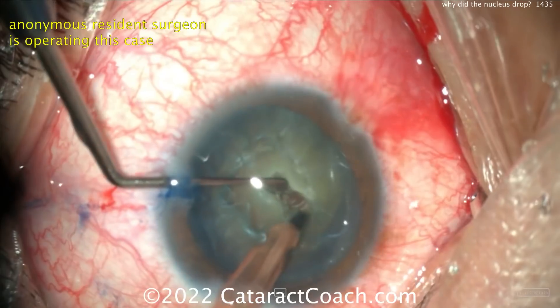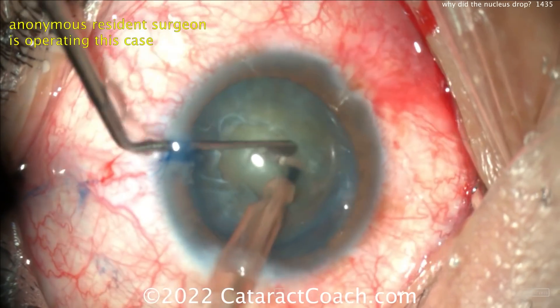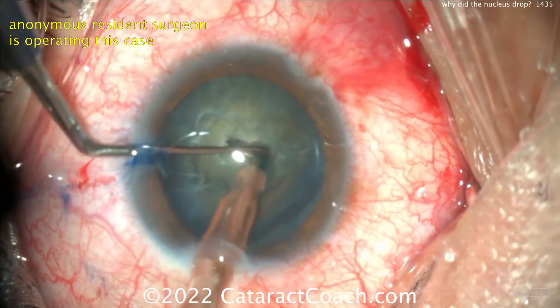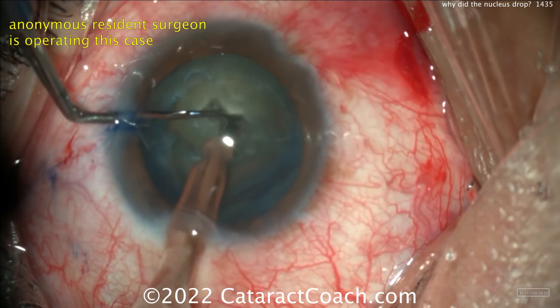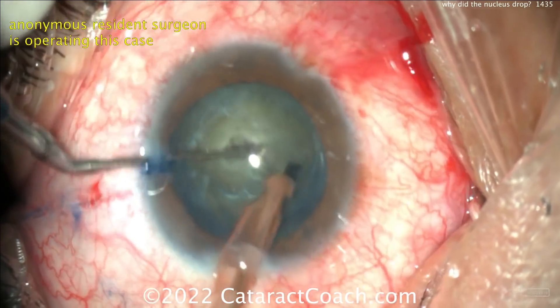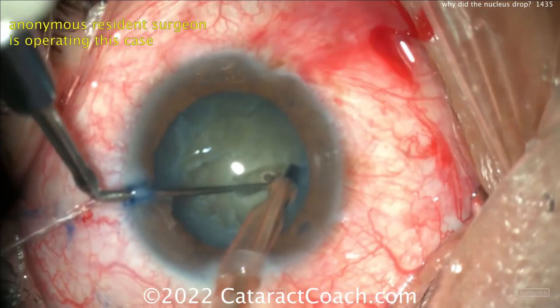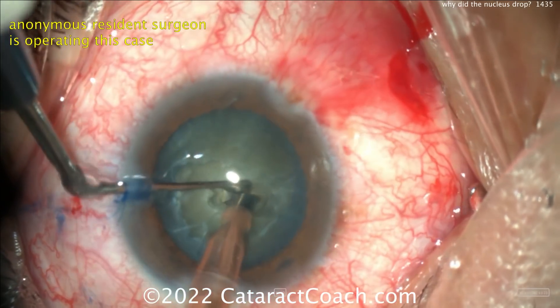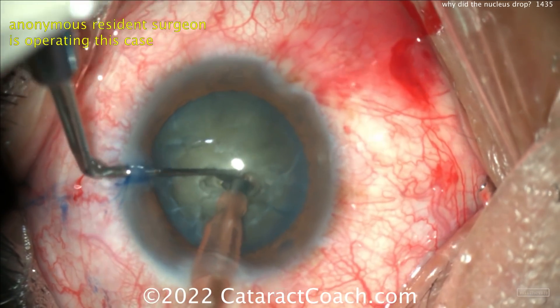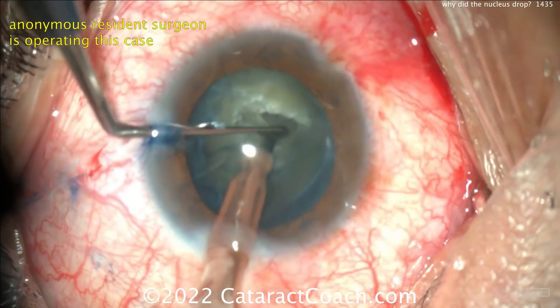Forget the upside-down text — the video was submitted originally in the non-surgeon view, and you like to see this view with the phaco probe right in front of you as if you're operating, so I flipped the video around. I would not split the nucleus here. I'd bring the nucleus up into the anterior chamber, use a chopper, pull it out of the capsule bag. If you do want to split it in the eye, fine — make it in two halves. But you need to convert to a manual extraction.